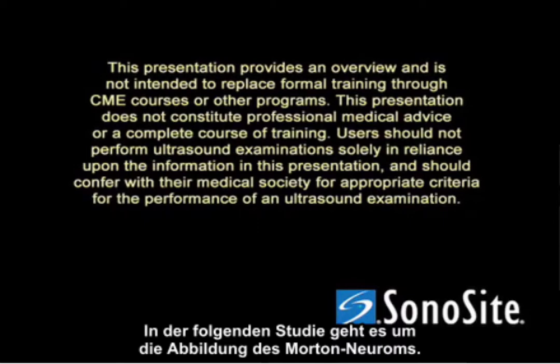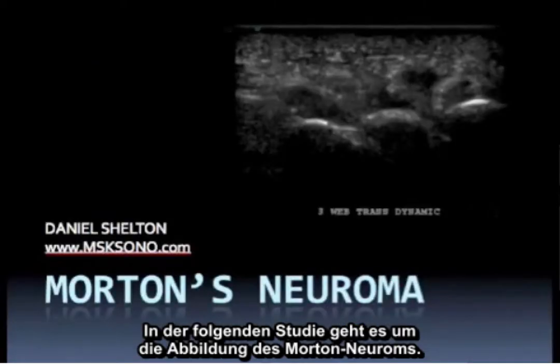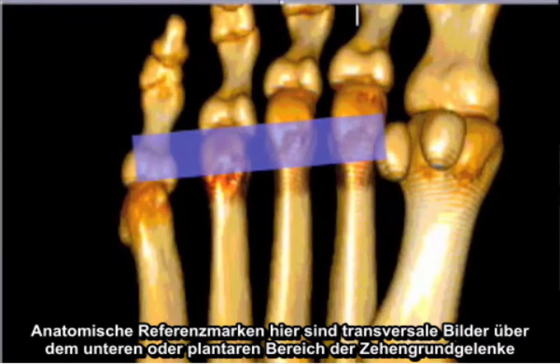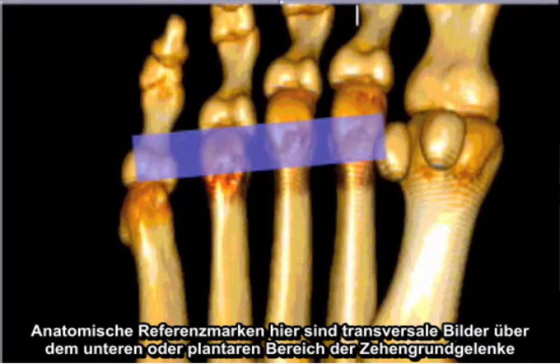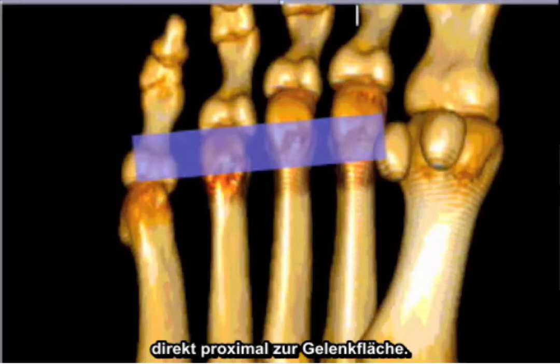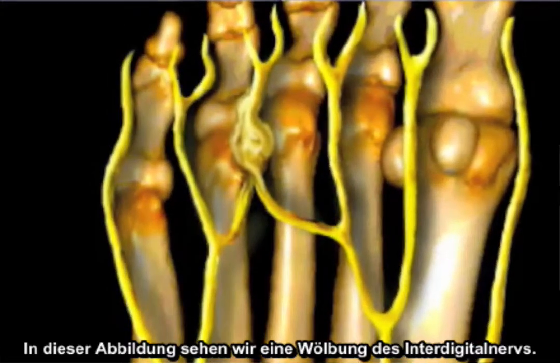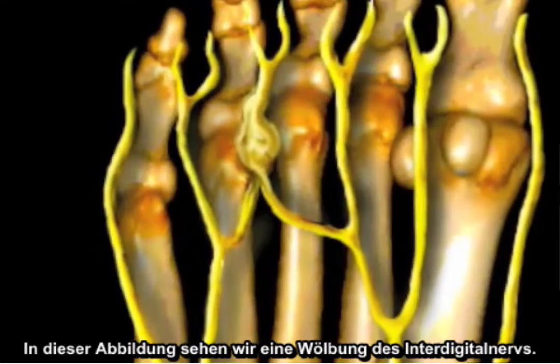The following study is imaging of the Morton's neuroma anatomical landmarks. Here is a transverse image over the plantar aspect of the MTP joints, just proximal to the articulating surface. In this illustration, we see a bulging of the interdigital nerve.